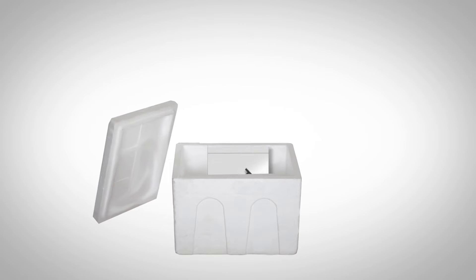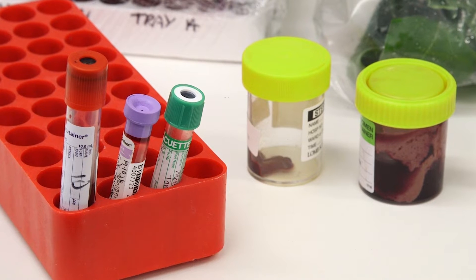Triple packaging has three crucial components: the primary receptacle, secondary packaging and outer packaging. The primary receptacle must be leak proof.